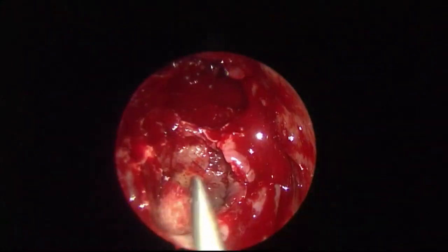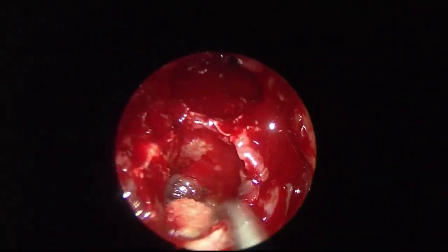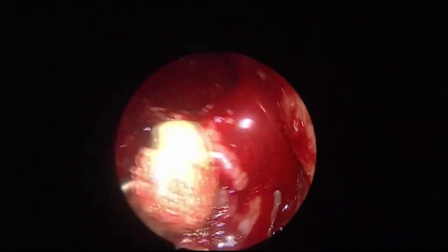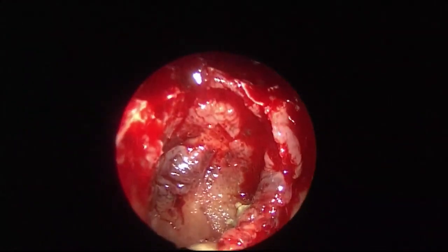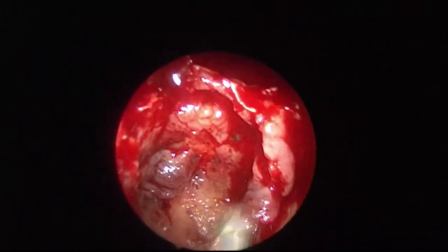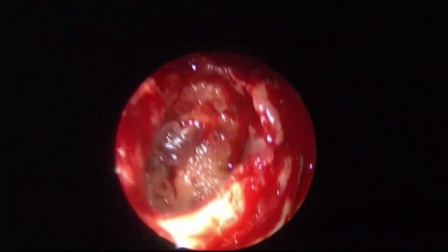Do you need an inferior meatal antrostomy to clear that? Not really. See, just mopping. Okay. Can you see something? Yeah, yes, you can see. See how it brings out. Some more. We'll do more. More mopping. Once more.